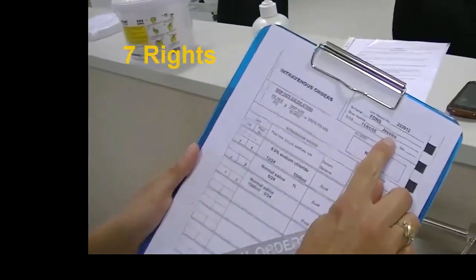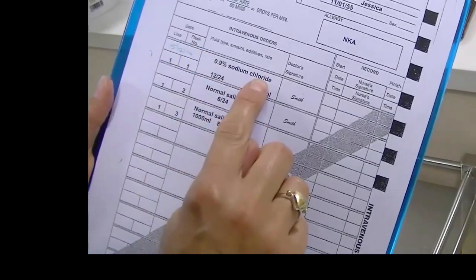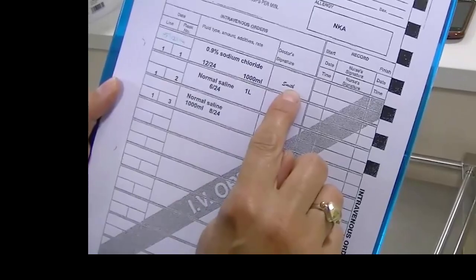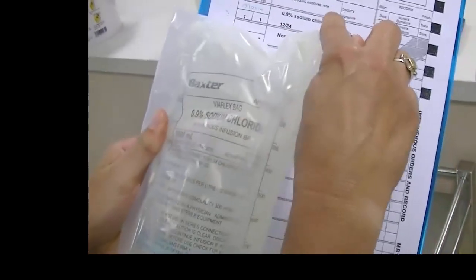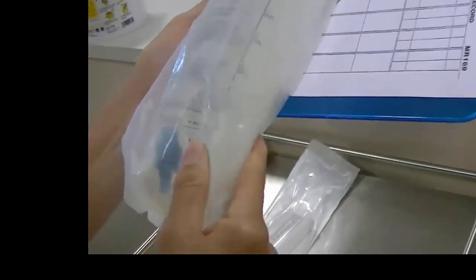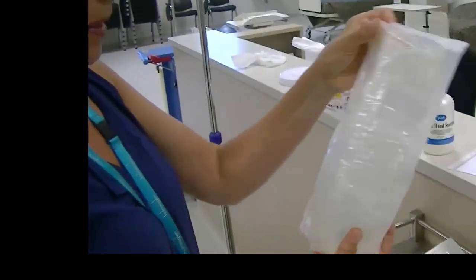So here I have Jessica Fong. It's an IV order. It's flask number 1. It's 0.9% sodium chloride. It's to run over 12 hours. 1,000 mils, ordered by Dr. Smith. You can see here I have 0.9% sodium chloride. Same as that, 1,000 mils, and it's actually in date. It says January or June, can't see it, but 2016. And if I was to look at it, the bag's intact and there doesn't seem to be any contaminants.